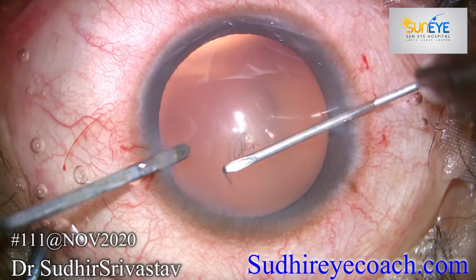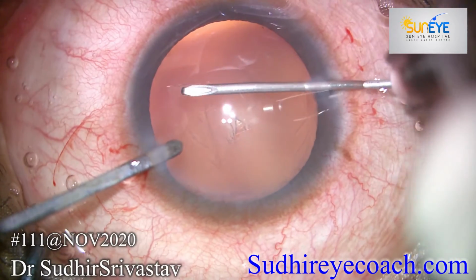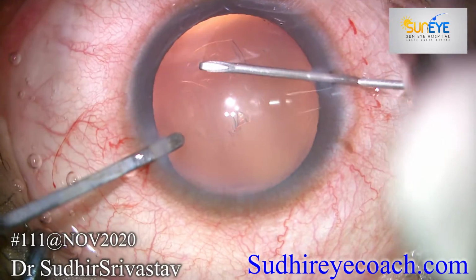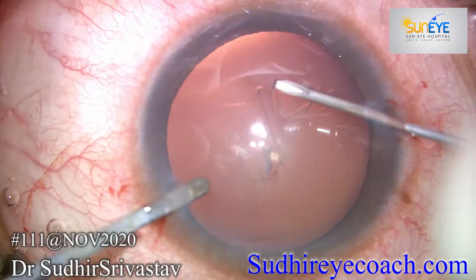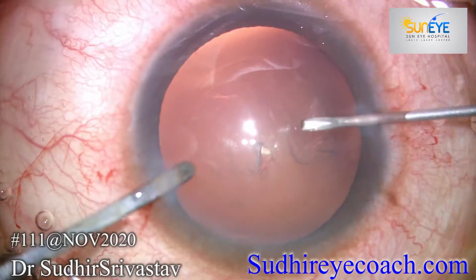For the capsulorhexis, do not take pupil size as a landmark. His white to white was big, so do not try to overshoot the size of the capsulorhexis. Always try to make it around 5 or 5.5 mm.